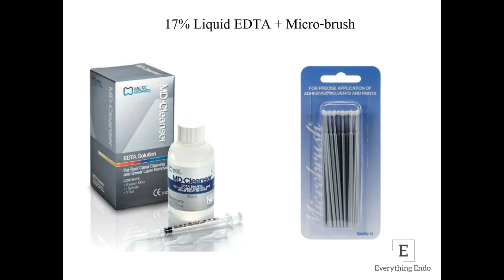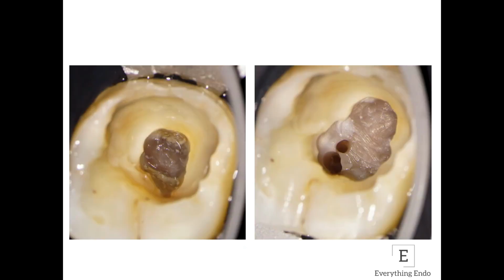17% liquid EDTA is one other thing which I use over and over again whenever I'm trying to look for anatomy. Whenever you have a pulp chamber that is filled with debris, all you need to do is leave a drop of liquid EDTA and scrub it well with these micro applicators. The most important thing when you're trying to look for anatomy is to make sure the pulp chamber is squeaky clean so that you'll know exactly where you want to work, rather than having debris lie all over the place and blindly digging into different areas.